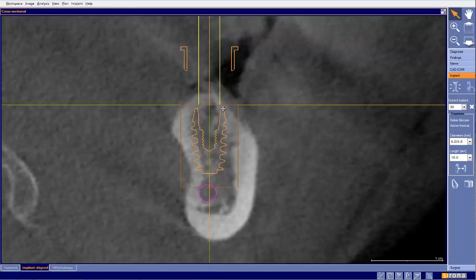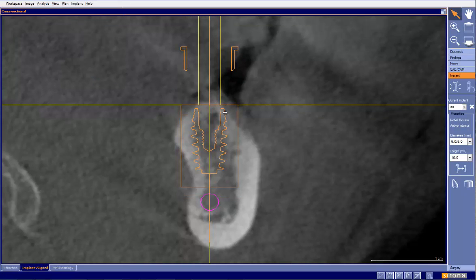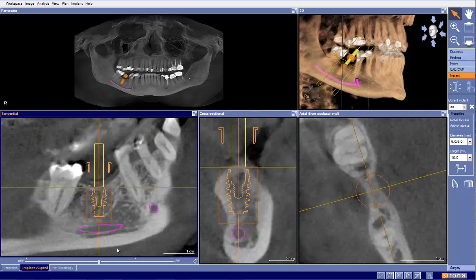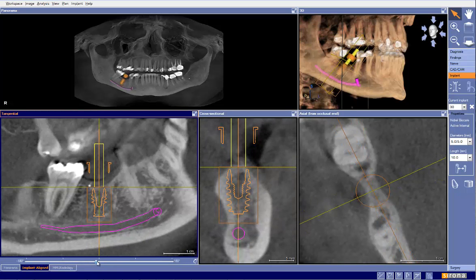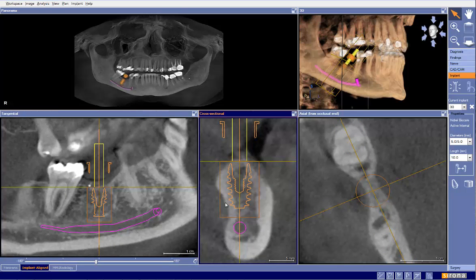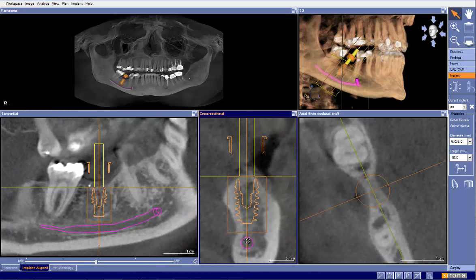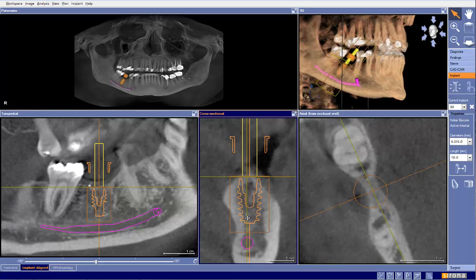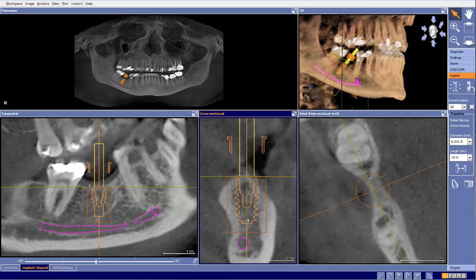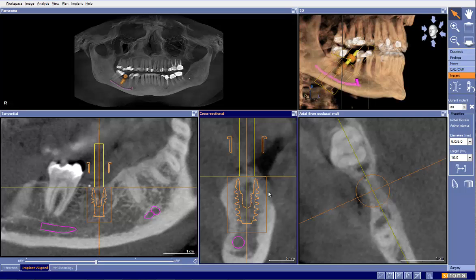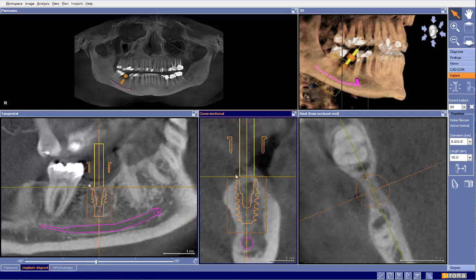To give you an idea of where we are — there we are before with your plan, and here we are where I would think of as the more bone-level position. The next on our list will be vital structures. The biggest vital structure we have in this area is the nerve, and we can see we have plenty of distance to it. However, the lingual concavity here is definitively a little close for my comfort. So I would consider moving this implant forward or tipping it forward to avoid that lingual concavity.